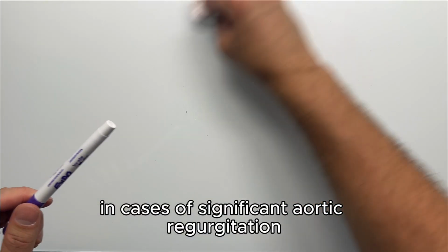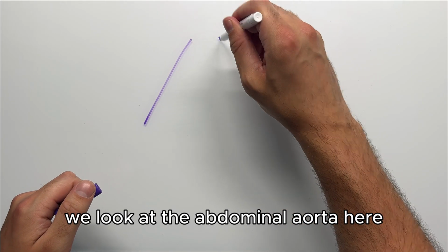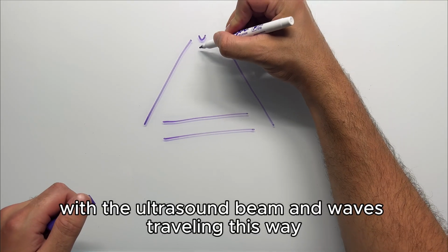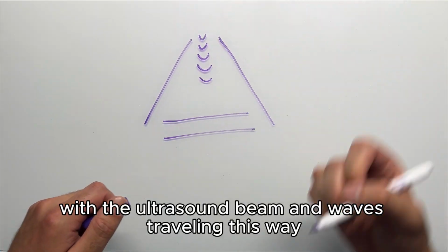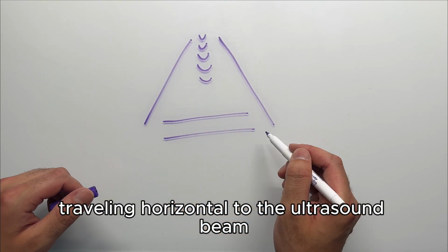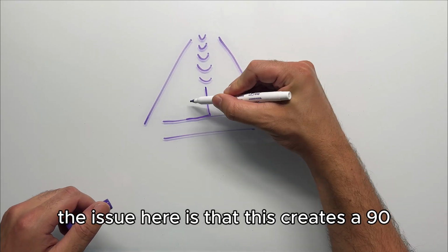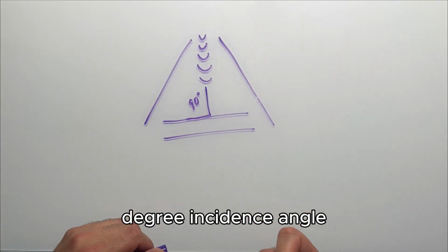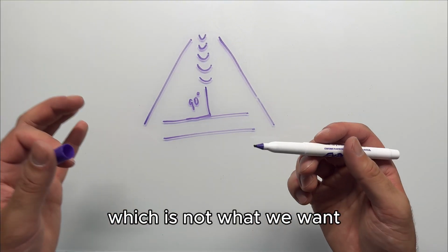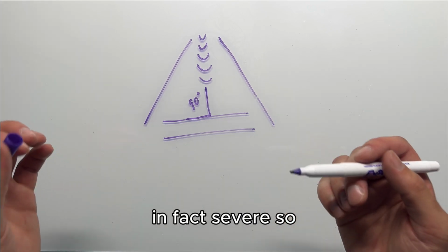In cases of significant aortic regurgitation, we look at the abdominal aorta here in the subcostal view. With the ultrasound beam and waves traveling this way, it's common to see the abdominal aorta traveling horizontal to the ultrasound beam. The issue here is that this creates a 90-degree incidence angle, which yields a poor Doppler signal, which is not what we want when trying to prove that aortic regurgitation is in fact severe.